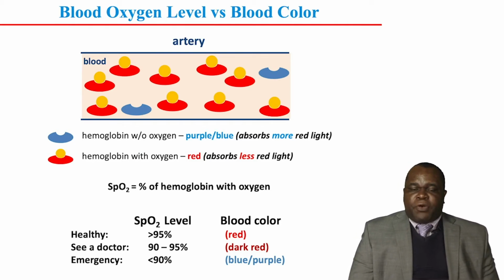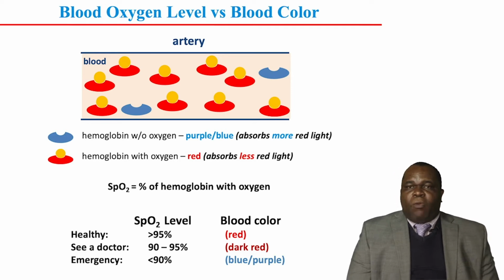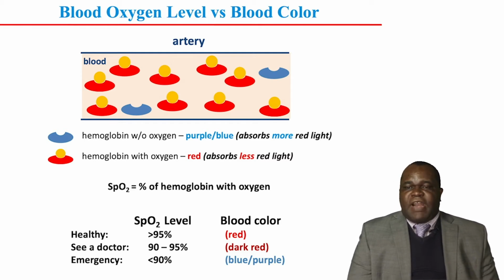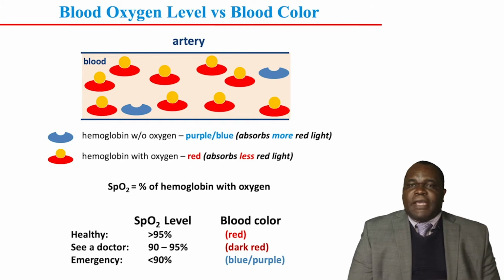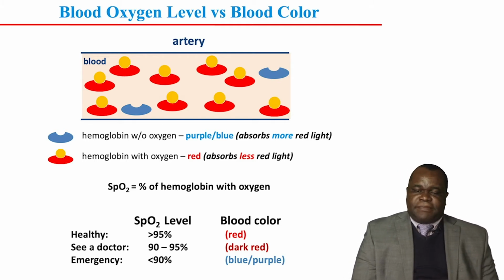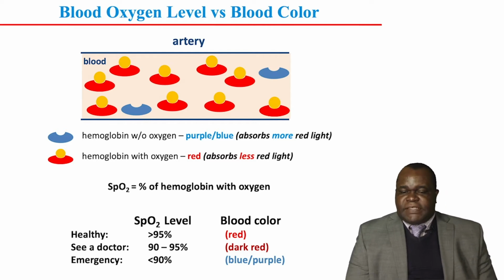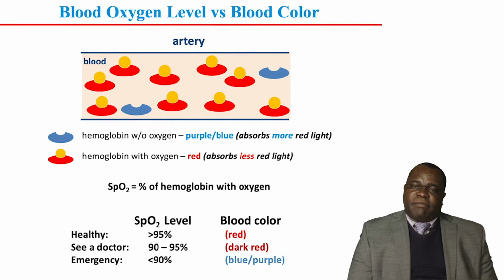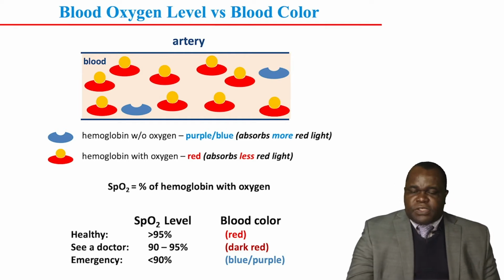Blood has a protein which is called hemoglobin. When hemoglobin has no oxygen, the blood looks purple or blue. Hemoglobin with oxygen, the blood looks red. So this differential absorption of light can be exploited to measure oxygen saturation levels in the blood. Below 90%, the blood looks purple and it becomes a medical emergency. For healthy, which is above 95%, blood looks red.